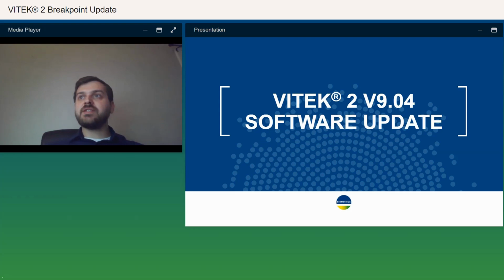And this leads us then into one other piece of technology that's going to be helpful regarding breakpoints, and that is software maintenance release 9.04, which is coming later this year. So this maintenance release, like many other maintenance releases, had the main goal of helping fix anomalies that exist with existing software versions, right? So with software version 9, a lot of you are probably at software version 902. We'll be going to 904 soon. There have been some known anomalies that have been identified, and this software maintenance release will resolve those. So you'll notice some of those are listed here.